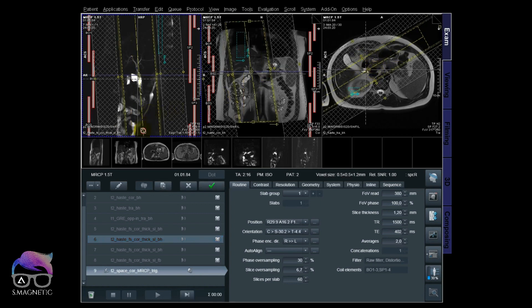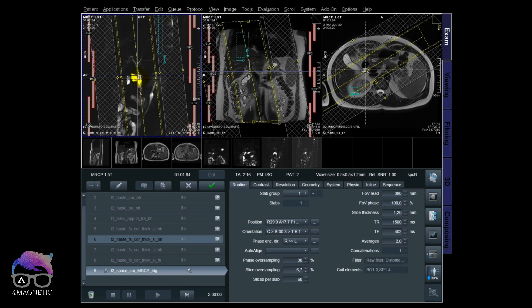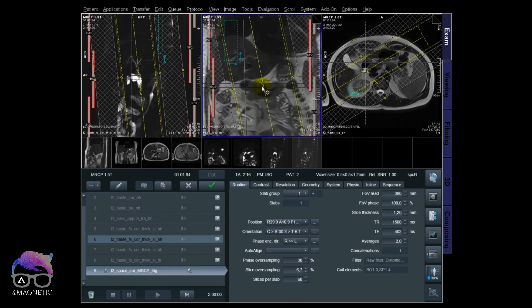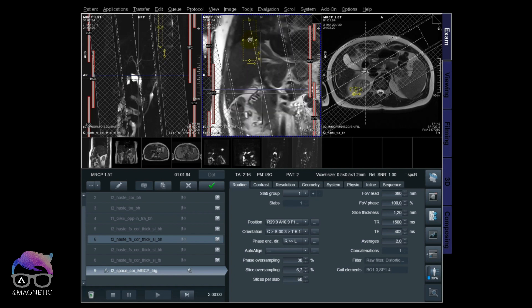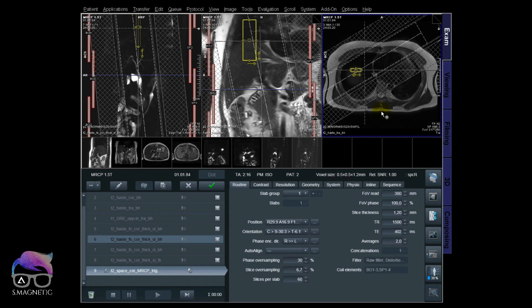I'm copying the oblique coronal and checking the free breathing image, because whenever you're doing a free breathing sequence you must look at the free breathing image for positioning — you can't position a free breathing sequence on a breath hold image or you'll miss the anatomy. I check coverage, then position my navigator: half of it in the lung and half in the liver.